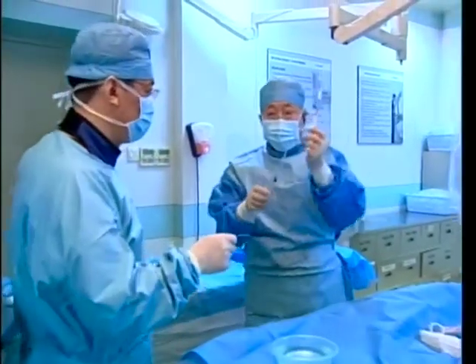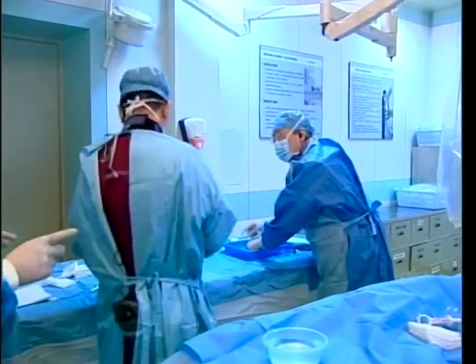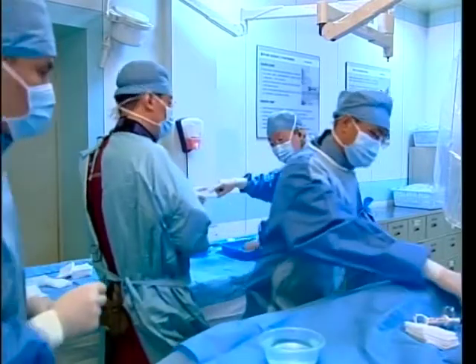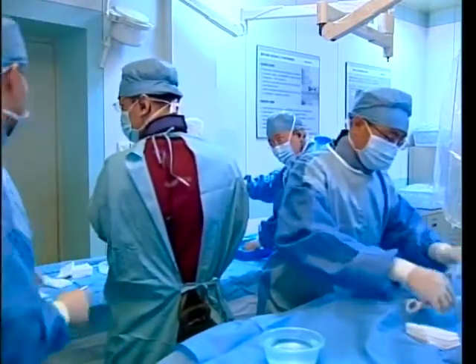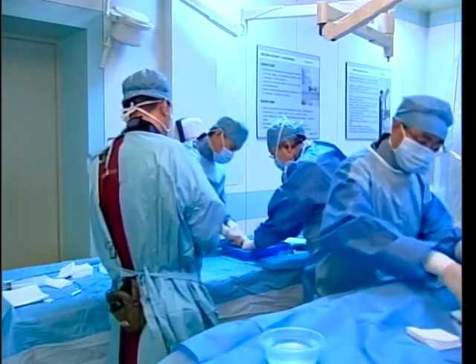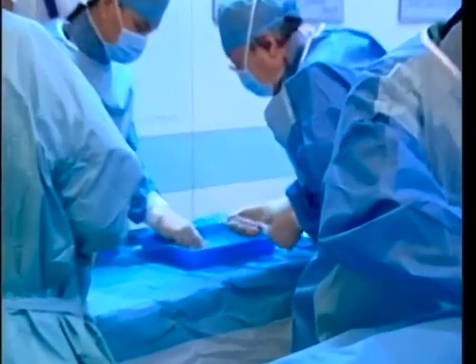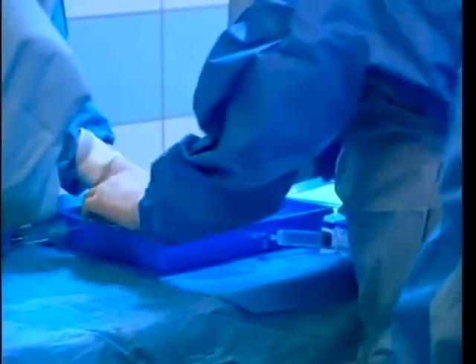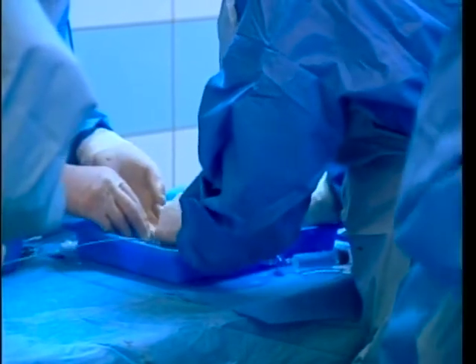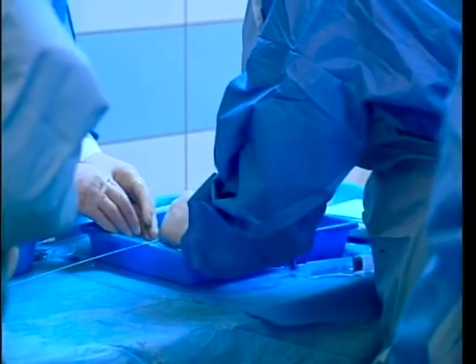That's important. So now we de-air. Can you come here? I think for most people closing the appendage, they would choose an occluder that usually would stand against the appendage wall based on the measurements. But for this device, the big hooks actually were designed to be trapped in the pectinate muscle. So even in this case, although he chose 28, I think even with 26, the device is very stable.